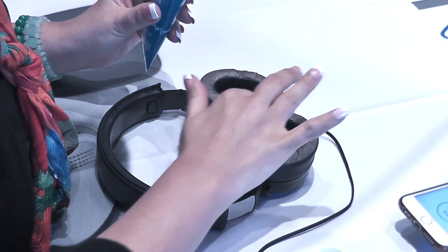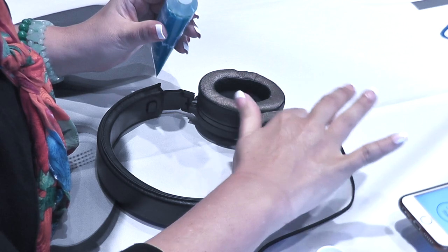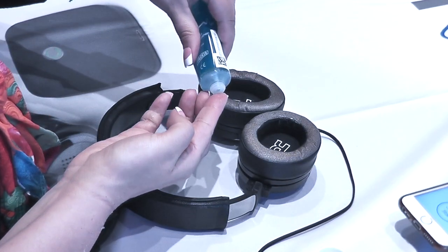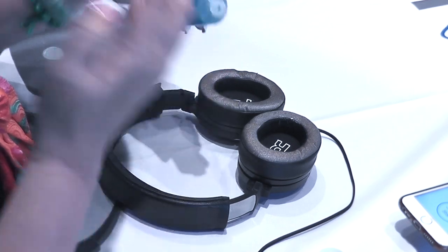Remove any earrings, piercings, hearing aids, or jewelry before starting treatment. Apply a layer of conductive gel or, if not available, water at the point of skin contact behind each ear area (mastoid) and also to the gold-colored skin mastoid contact portion of the ear cushions.